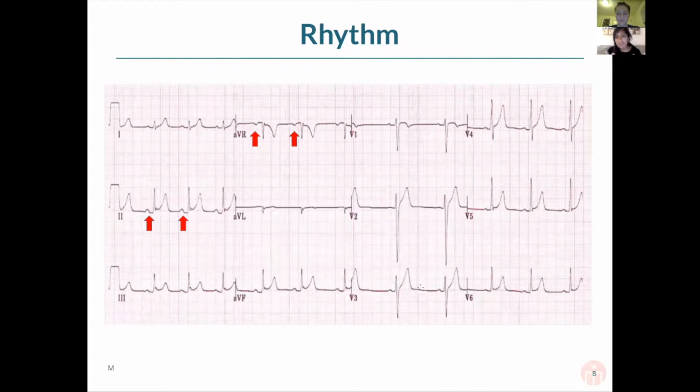And so the first thing that I'm sure all of you have heard in every EKG lecture is look for the P's and the QRSs. And that really does stand true. So what I really try to identify is look for anything that could be a P wave. And so don't necessarily look right in front of the QRSs, because that's where it's supposed to be. But certainly if you're getting EKGs on a lot of the hospitalized patients, that's not where it'll be. But you need to have a P before every QRS and a QRS after every P for it to be sinus rhythm.